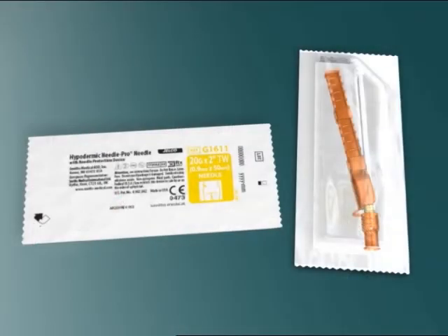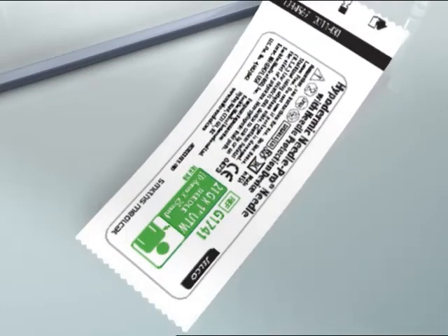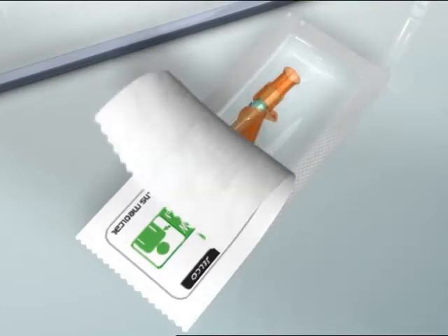Select the appropriate needle. For gluteal injection, select the 20-gauge thin wall 2-inch needle, which is the longer needle with the yellow colored hub in the blister pouch with yellow print. For deltoid injection, select the 21-gauge ultra-thin wall 1-inch needle, which is the shorter needle with the green colored hub in the blister pouch with green print. After you select the correct needle, peel the blister pouch of the NeedlePro safety device open halfway.